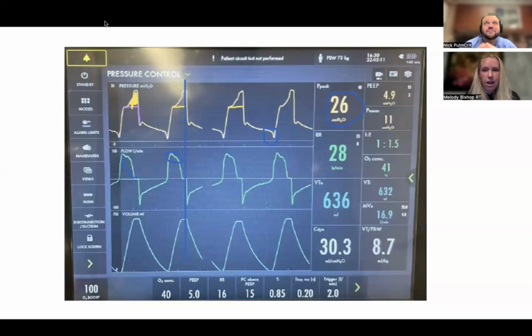Yeah, that's fine. I knew you were going to say that, and I set you up to say it. I very much agree that it gives the patient the least amount of freedom. Maybe not from just the four settings standpoint, because in reality you do set a volume. The problem is, as the patient participates more and more, the ventilator changes more and more. So it's not from a setting standpoint.